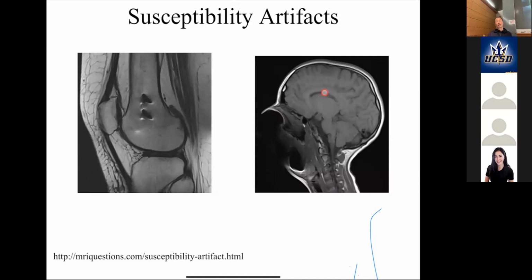It's a great question, because just this year we've had to change our screening policies. More and more, the newest trend in fashion is smart clothing, where you've got wires and stuff in your clothing. Does anyone know more about this? I don't know enough about this, sorry. But now we have to screen for special clothing, to make sure the clothing isn't electrically active. And then a few years ago, a lot of people were getting tattoos, and tattoos have metal in them. Especially if you have tattoos on your face, it can be very sensitive and cause current issues. So there's a lot of interesting things that happen.